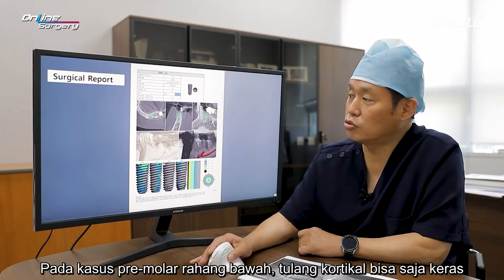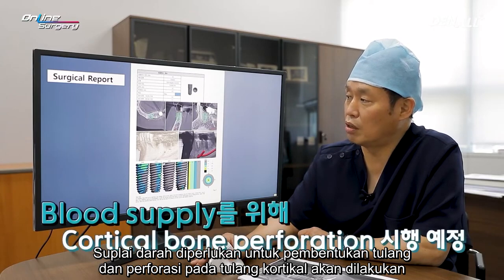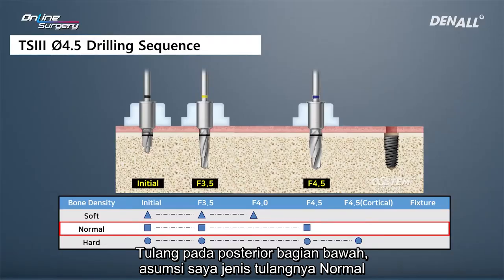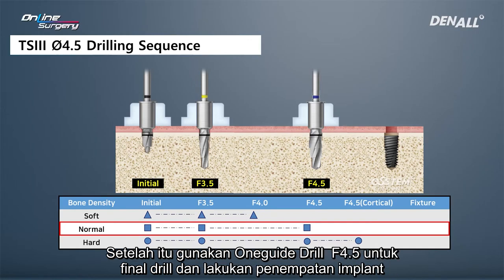In the case of lower premolar, the cortical bone can be hard. For bone formation, blood supply is necessary, so perforation of the cortical bone will be done. A TS3 diameter 4.5 by 10 millimeter implant was planned. The bone itself is in the lower posterior area, and I assumed it was normal bone. After the initial drill, a 3.5 one-guide drill is going to be used. After that, a 4.5 one-guided drill will be used as the final drill and the implant will be placed.